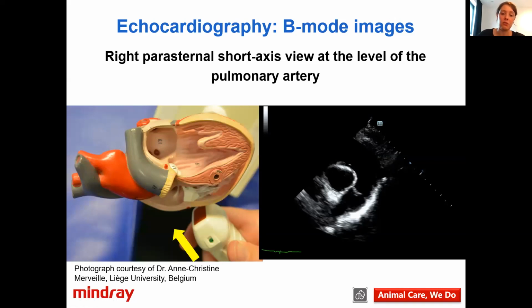And if you want to measure a velocity using spectral Doppler, you have to aim your probe so that you can measure as parallel as possible to the blood flow. This is really, really important, and it's something that everybody has to practice a lot, because if you make an angle with the blood flow, you will underestimate the velocity. So for velocity measurements, we need to make images that are optimized in a way that you can do a correct angulation of your Doppler measurement.